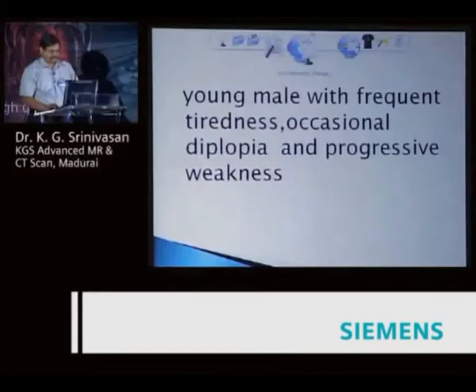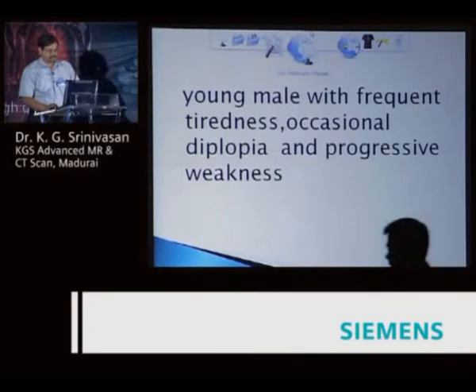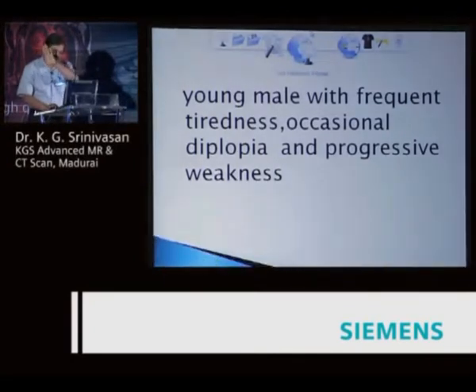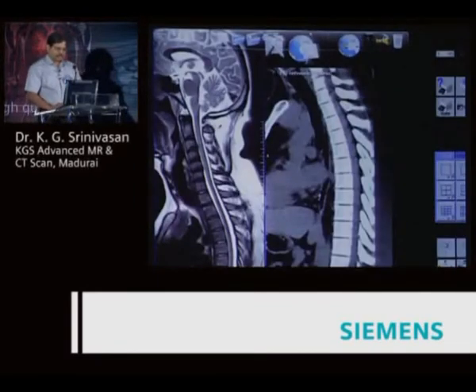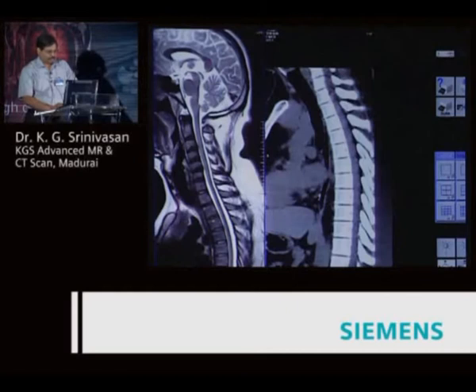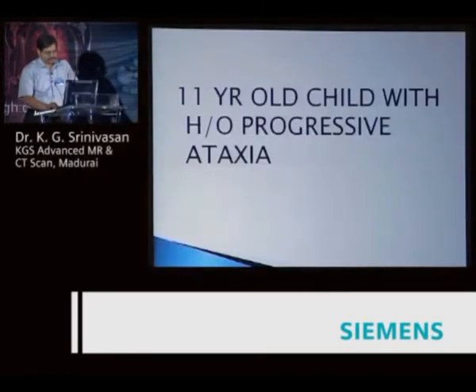Even though they asked only for lumbar spine workup: acute onset weakness, young male with frequent tiredness, occasional diplopia, and progressive weakness. The whole spine was negative in this patient, but when carefully looking, you can see there is a lesion in the anterior mediastinum — because of thymoma. The patient is presenting with myasthenia gravis, responsible for all these symptoms.